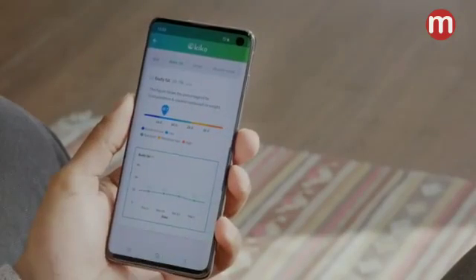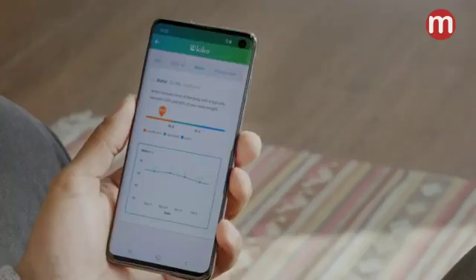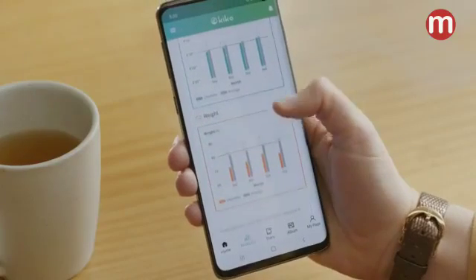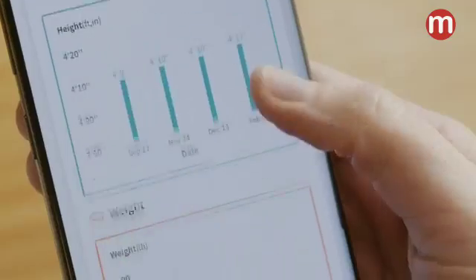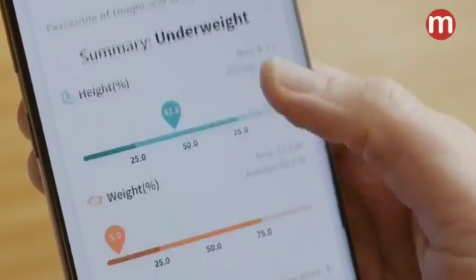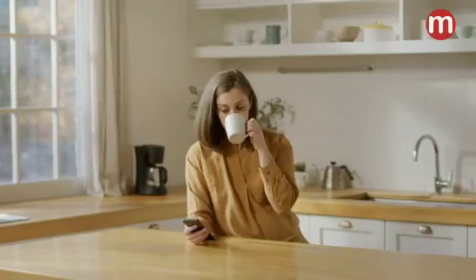All records are saved in the app, so you can easily track changes. You can even compare your child's data against similarly-aged children in the provided WHO database and closely monitor your child's growth development.